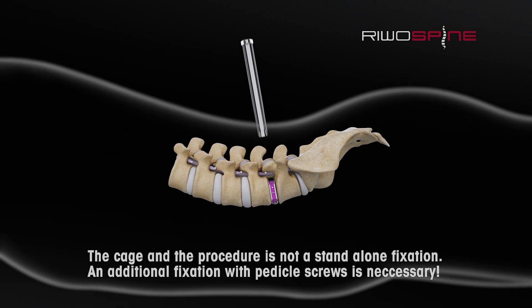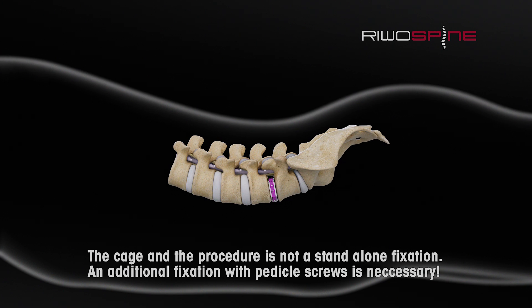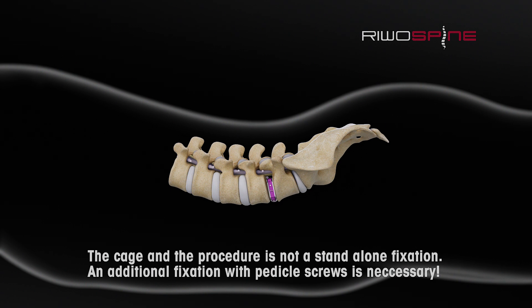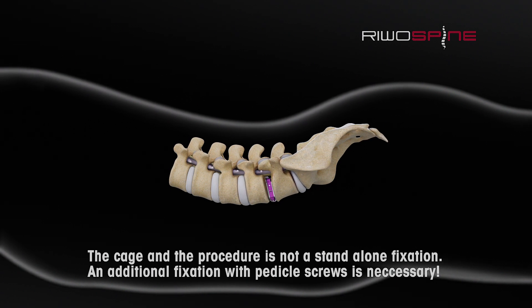Full endoscopic interbody fusion with the vertebrous endoscopic system is a minimally invasive solution for this standardized procedure in spine surgery, with key advantages in visualization, handling, and patient care.